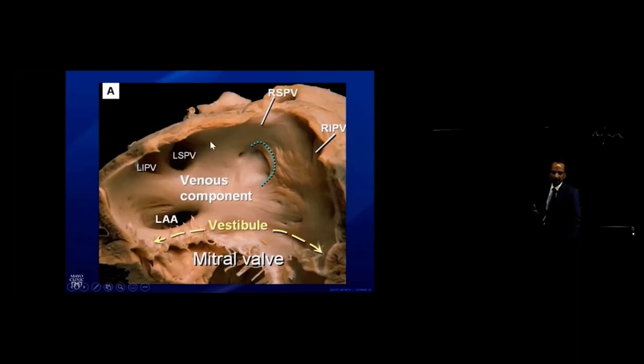Many times it's iatrogenic flutters after an ablation that we've done in the left atrium, so we have to, or have already, isolated the vein. But that's a very important concept, especially for those who are new to EP, to understand that a line has to be anchored. And that anchor is an artificial anchor in the case of the left atrium.